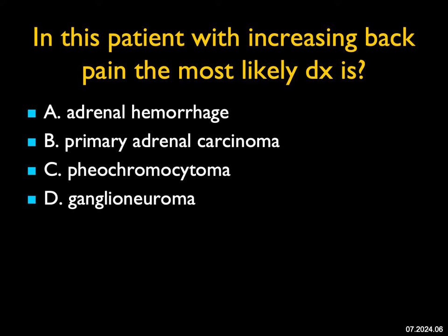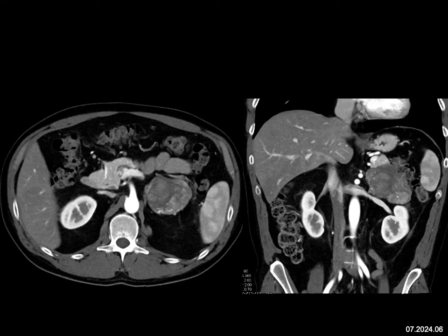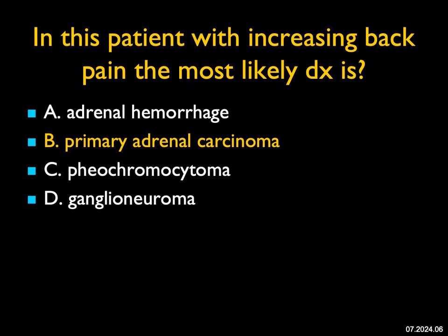In this patient with increasing back pain, what's the most likely diagnosis? This is kind of a tricky case. There's roughly a 5-centimeter mass in the adrenal, pushing down on the left kidney. It's somewhat vascular and solid. You could think about hemorrhage, but then you've got to think: what is the underlying mass? Pheochromocytomas are typically hypervascular — this has some vascularity, not the extent we'd typically like to see with a pheo. Ganglioneuromas are typically of lower CT attenuation. So that leaves us with a solid vascular mass that looks concerning, and this was a primary adrenal carcinoma. It's a good example showing that primary ACCs are not always going to be very large tumors.